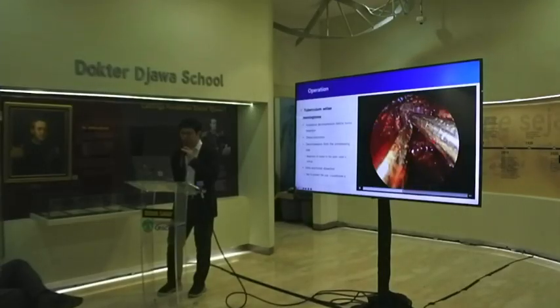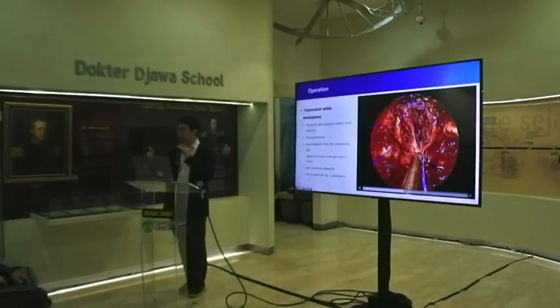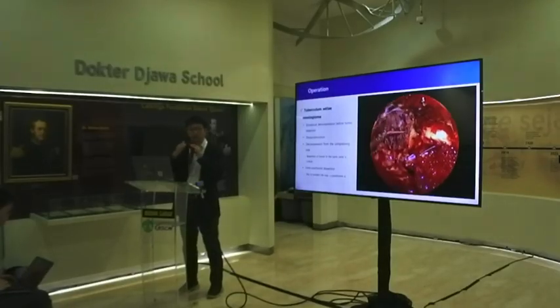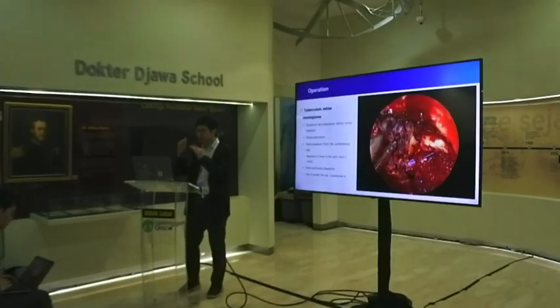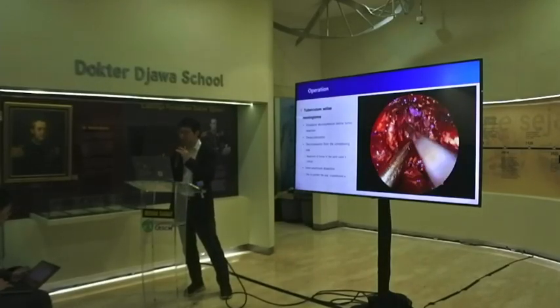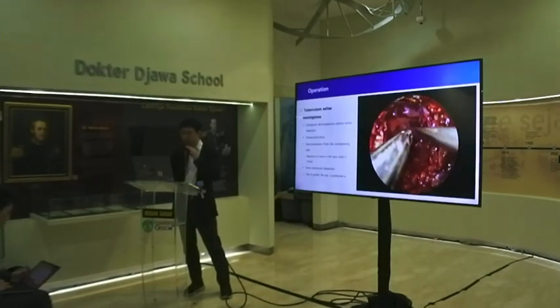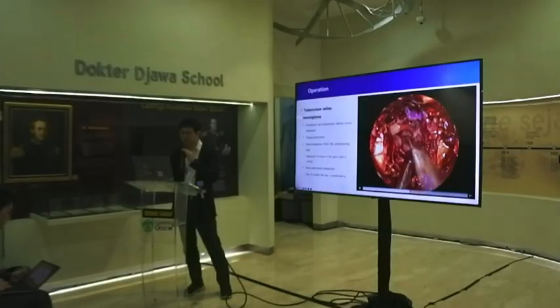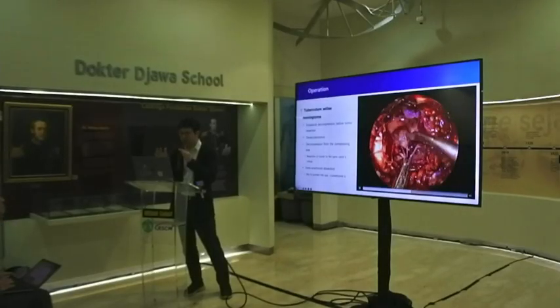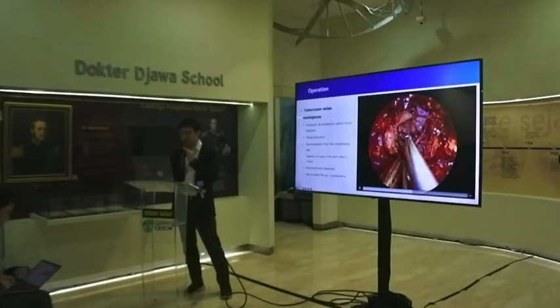You can do the durotomy like this, and for tuberculum sella meningioma cases, always keep the arachnoid plane. You can always get the anatomy of the arachnoid plane. If you keep the arachnoid plane, you can easily dissect the tumor from the optic nerves and the anterior communicating arteries. That's how we prevent injury to some very important neurovascular structures around the tumor.